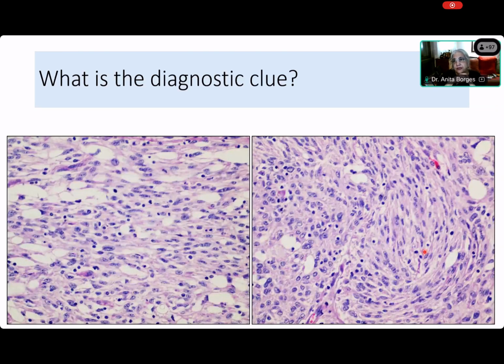Now come on. What is it that we have missed? And what is the diagnostic clue? Lymphocytes. Very good. Excellent, Elsa. So now what does this mean? Inflammatory. Oh, so you think that we should do ALK? Now look very carefully, Elsa, and tell me, besides lymphocytes, do you see anything else? Any other inflammatory cells? No, ma'am. There are no plasma cells, there are no eosinophils, there are no neutrophils, there are only lymphocytes.